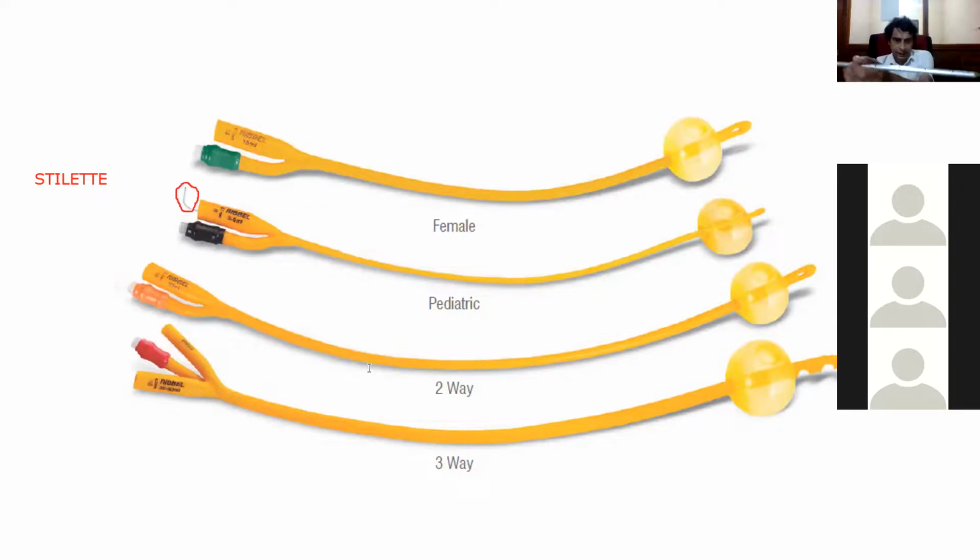Yes, sir. Right. So this IC tube that you see, the thing that goes inside this IC tube, this metal bit, this is also called a stylet. It makes it more stiff for insertion. The stylet makes it more unsafe. So IC tubes, we don't insert with a stylet. But a catheter, you might sometimes insert with this little plastic stylet and then pull the stylet out.